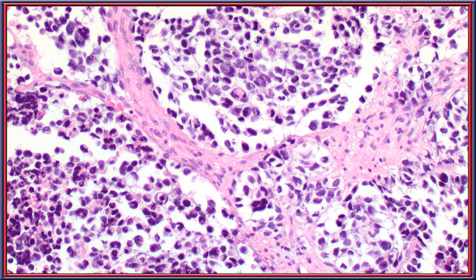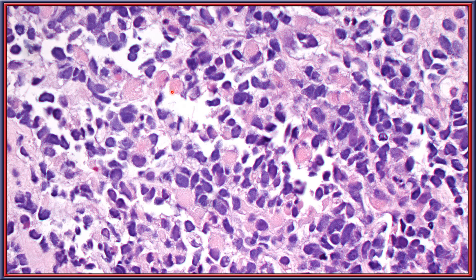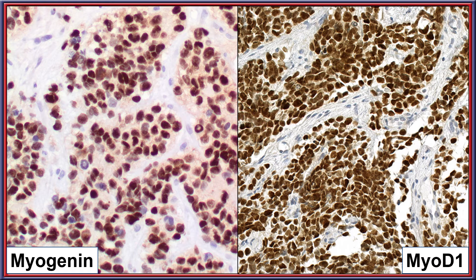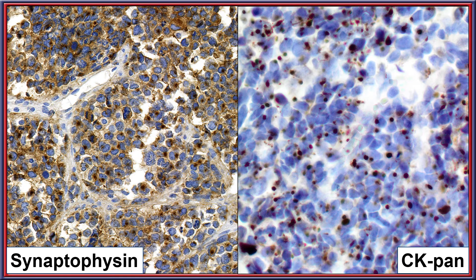On high power, there is an alveolar architecture with clinging cells at the periphery and dilapidated cells in the center. Rhabdomyoblasts are easily identified with eccentric eosinophilic cytoplasm pulled off from the nucleus. Desmin is strongly positive in the cytoplasm of most neoplastic cells, while myogenin and MyoD1 confirm the myogenic nature. A panel of immunohistochemical studies is necessary to accurately classify these neoplasms.